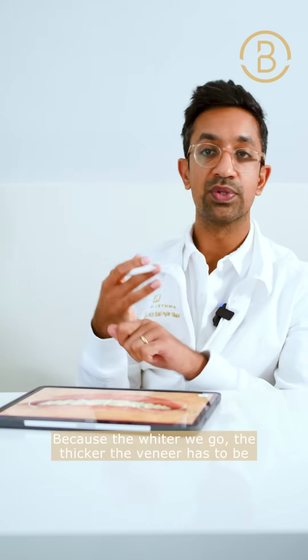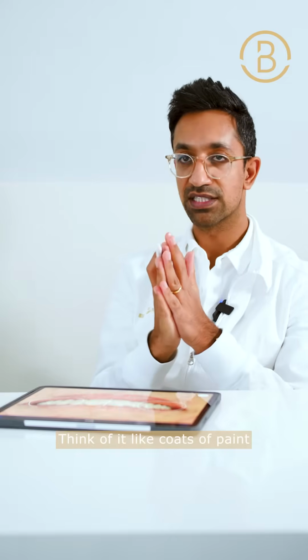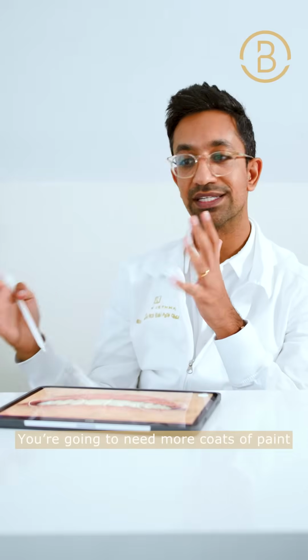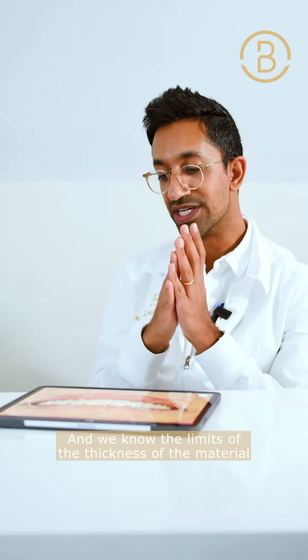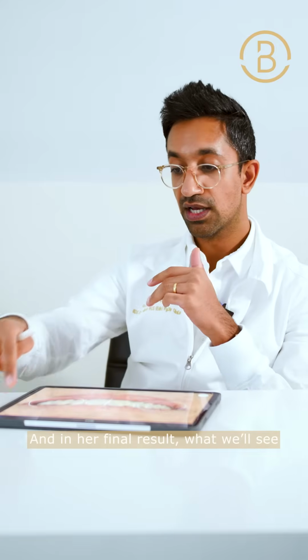the whiter we go, the thicker the veneer has to be. Think of it like coats of paint. You have a wall that's dark and you want the end result to be white, you're going to need more coats of paint. Exactly the same kind of situation we're thinking of with a veneer. So if we choose a good color here and we know the limits of the thickness of the material, we can do this without preparation.